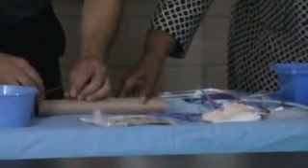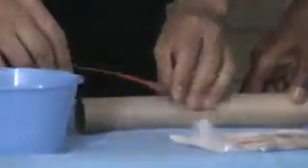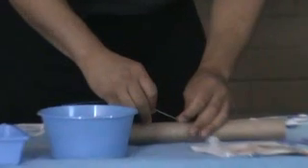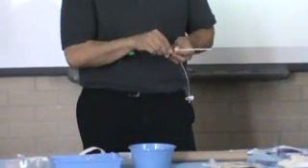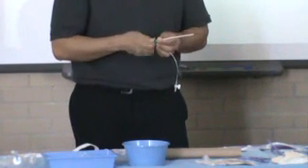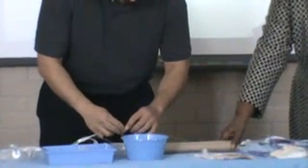So once he has access, the wire goes in. It's in far enough that he can put pressure on it and take out the needle. So the needle comes out, the wire's in there, he's applying pressure, and then they take their introducer sheath and thread it over the wire.